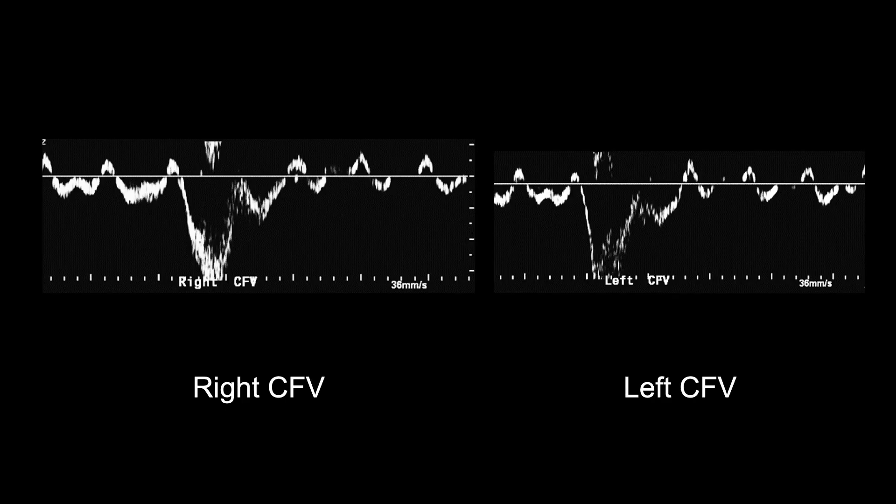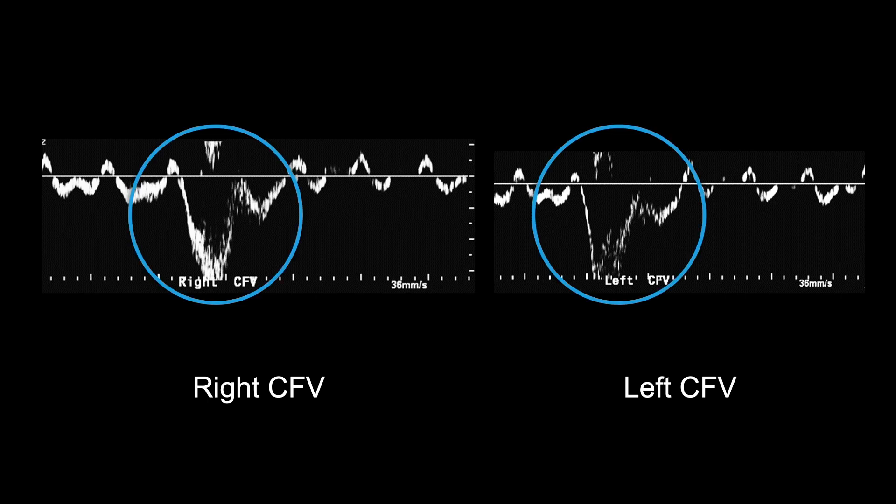In patients with right heart failure, a distal augmentation will produce a normal inverted peak below the baseline, indicating no proximal obstruction. If there was a proximal obstruction, an augment would be absent or diminished.